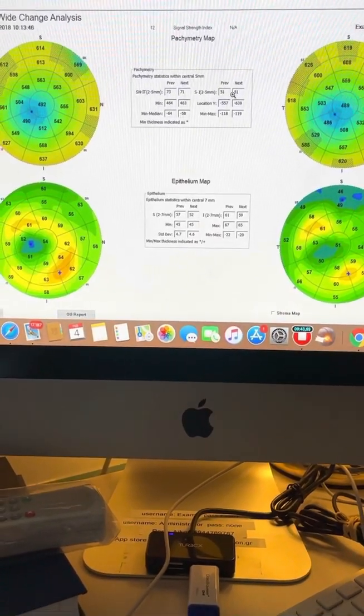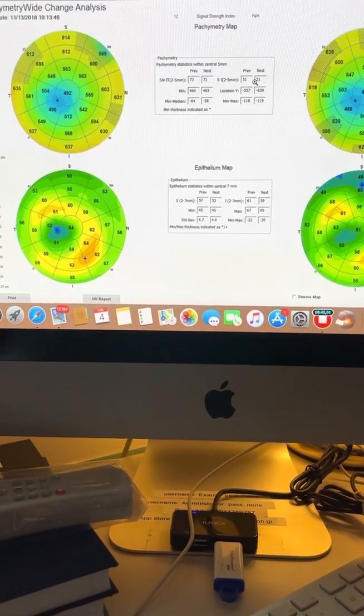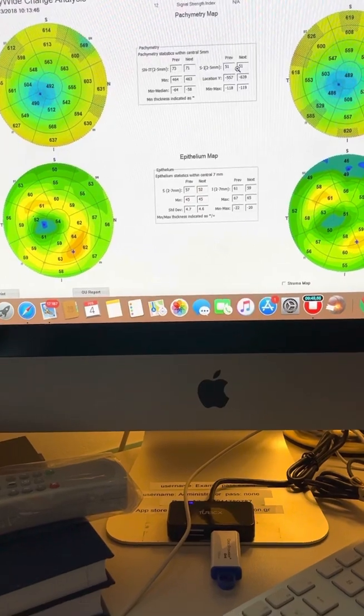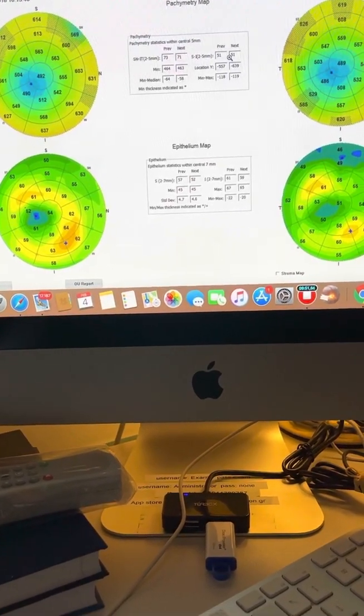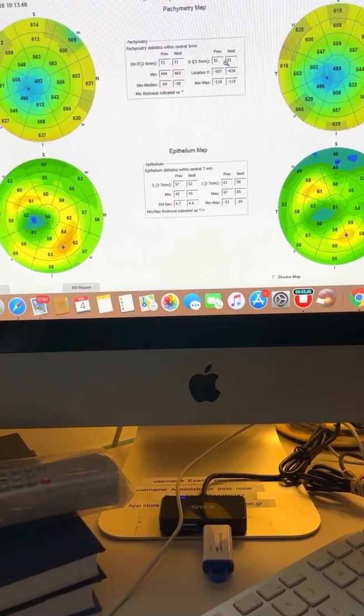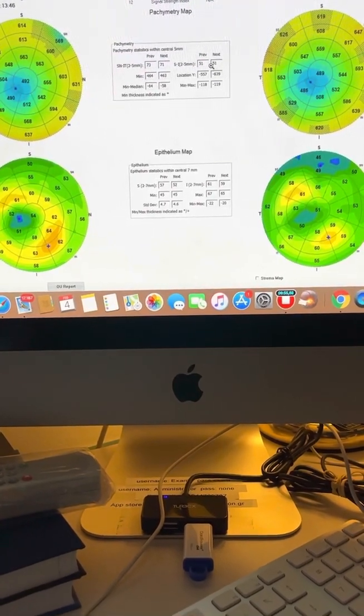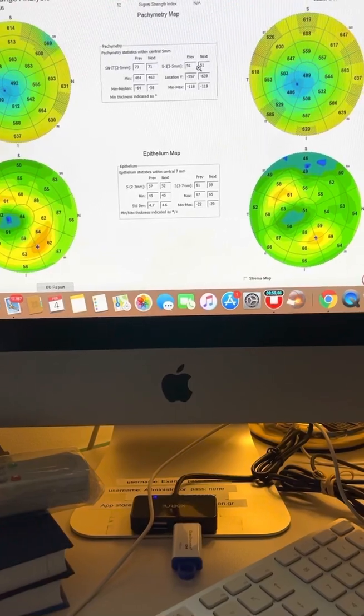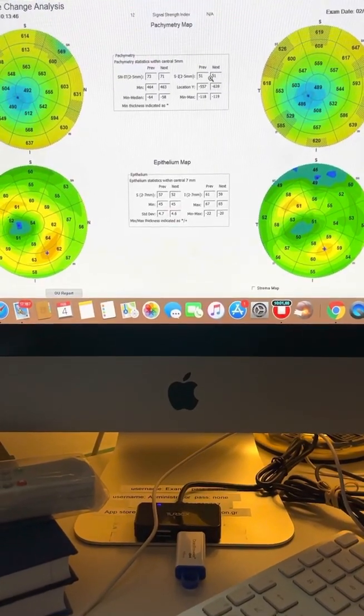And this is for us a point where the OCT, total cornea and epithelial mapping, helps us explain some findings in cornea tomography that could, if evaluated alone, create a little bit of concern for the keratoconus. Thanks so much for your attention.